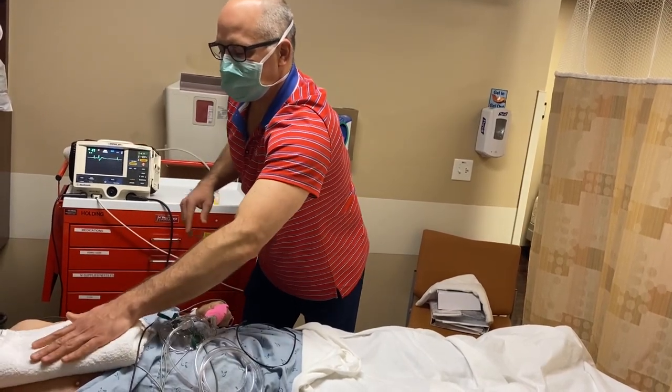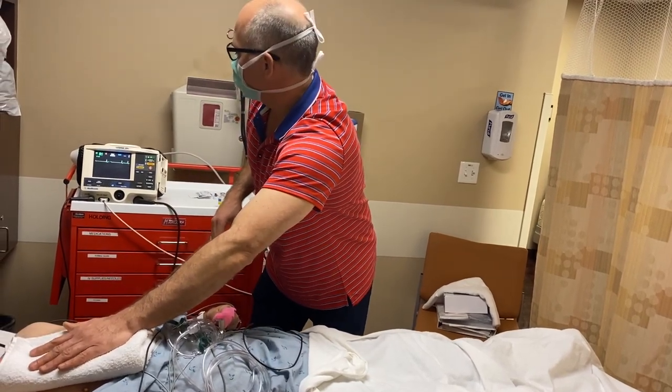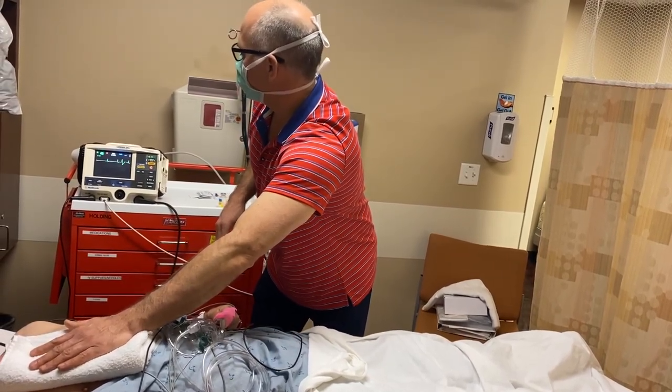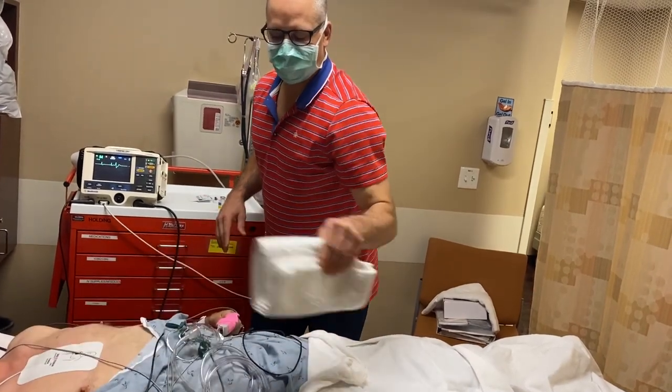The patient jumps like that because the chest musculature contracts with the shock energy, and that's why these folks have a little jump with the shock energy. A little bit of a workout in the morning.